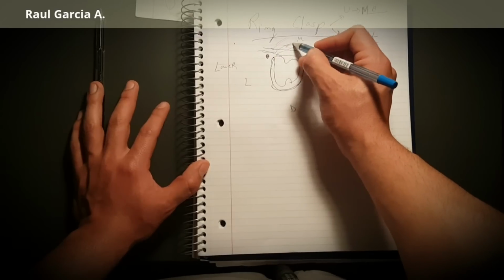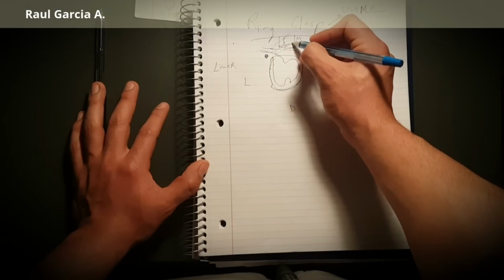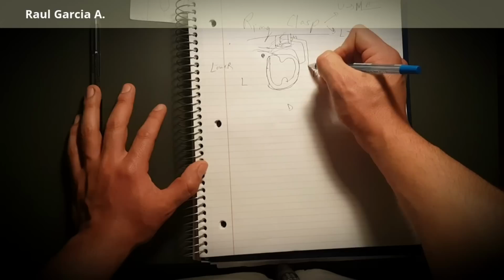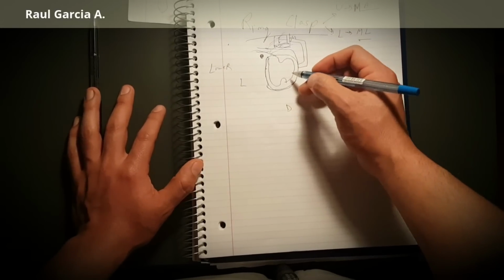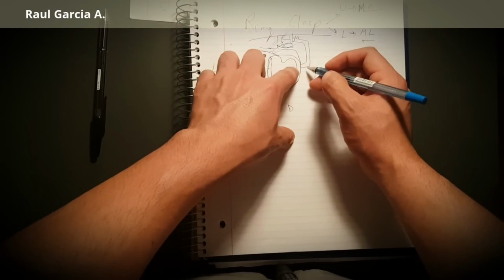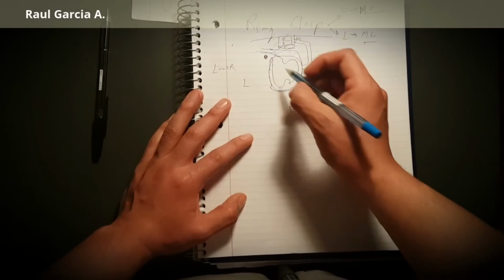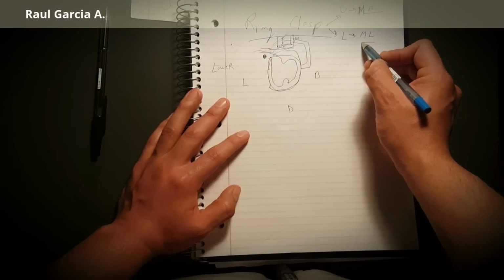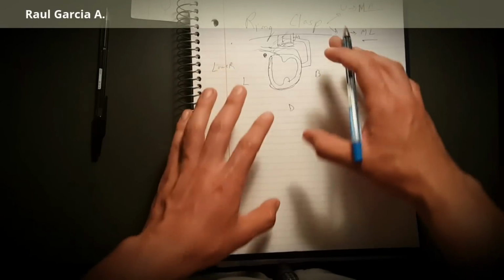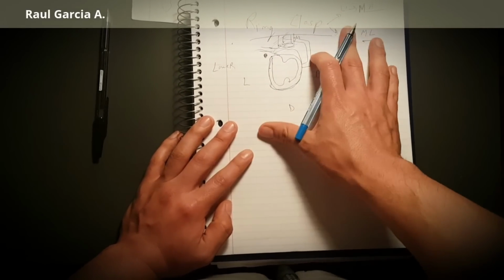But there was a saddle area here, so from there you're going to have your saddle area, and from here you're going to have another minor connector, another arm to reinforce this structure, because it is too long, so it would break if it's not reinforced by some structure. So this is called a ring clasp, to engage a mesial lingual undercut in the lower arch and a mesial buccal in the upper. So in the upper would be vice versa. Okay? So when do we use this one?